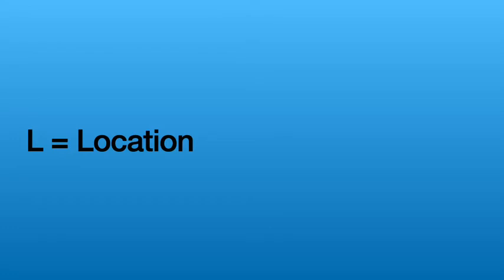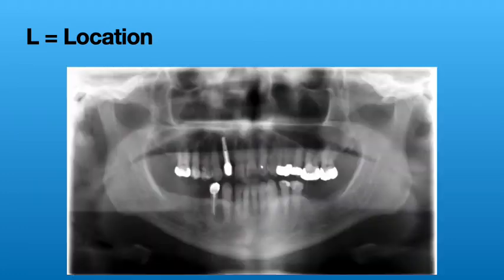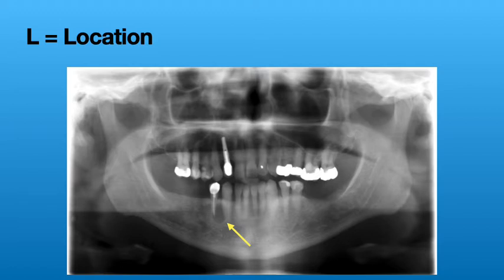We are now on to the LESIONS acronym, starting with L, which stands for location. This is pretty straightforward — it is simply where is the lesion. On this image, I'll give you a couple seconds before showing an arrow indicating exactly where that lesion is. The location would be the mandible, on the patient's right side, between the canine and the first premolar, in the mid-root area extending to the apices.